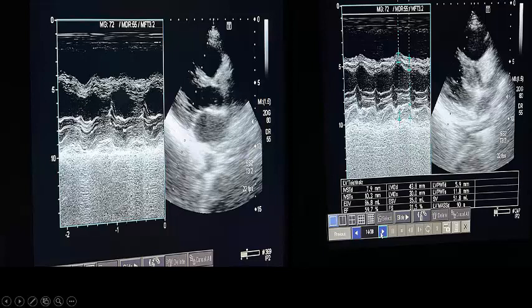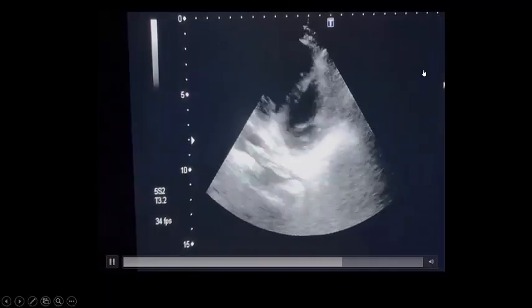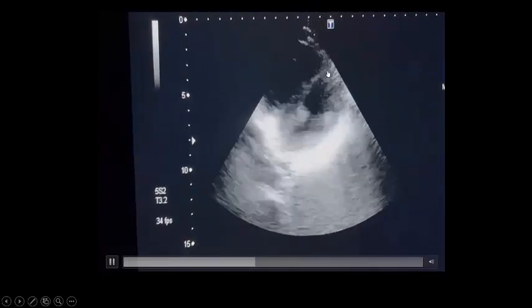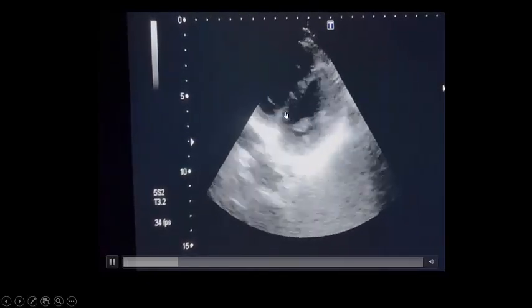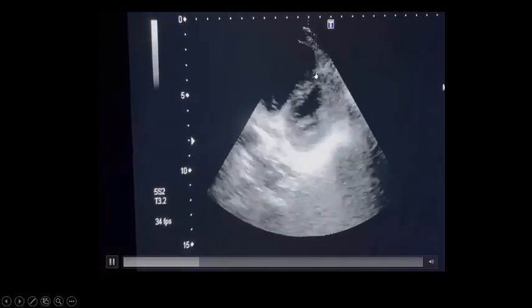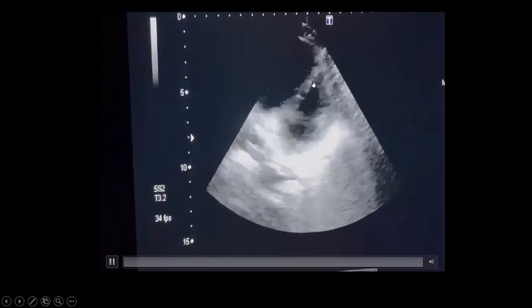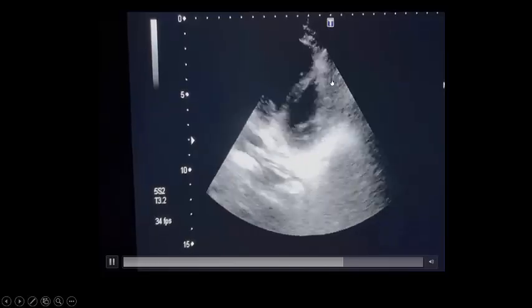With inspiration, you see the right side dilatation increases — this is ventricular interdependence, because the right side is markedly dilated with increased blood flow during inspiration, shifting the septum towards the left side. Also, in systole, at the end of systole there is a dyskinetic movement where the septum moves toward the right ventricle due to late contraction of the right side. In short axis view, the right side is markedly dilated, compressing the septum and leading to a D-shaped left ventricle.